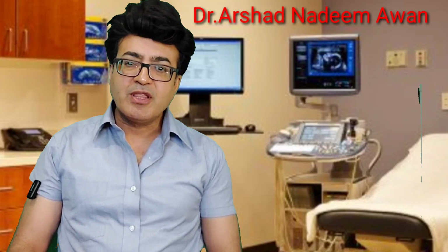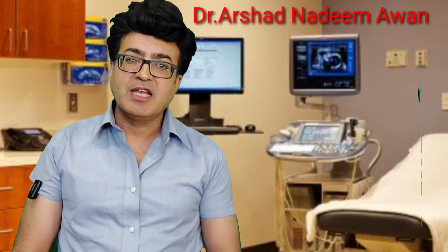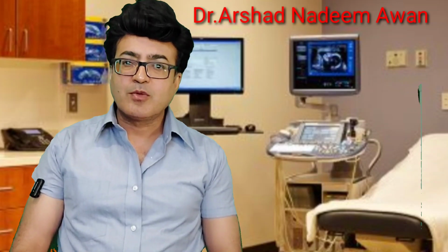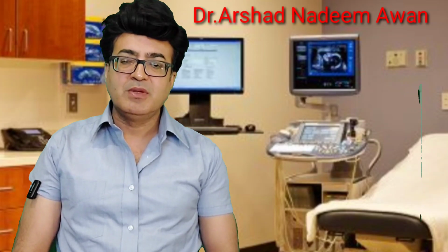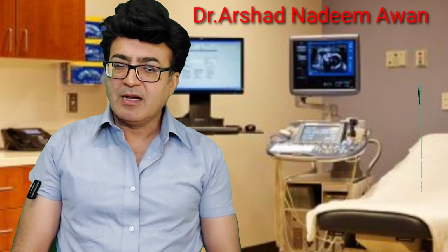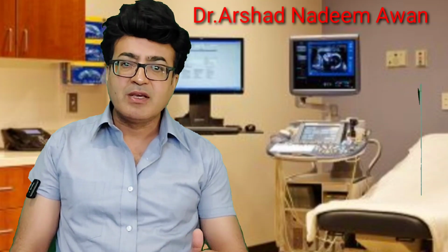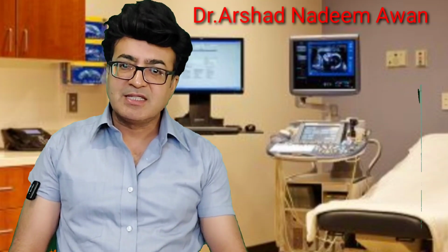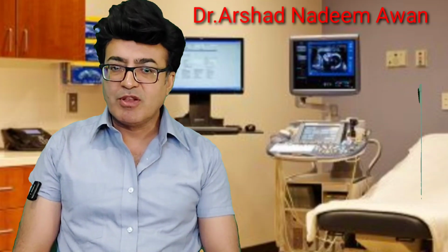So now the first important thing is when we will apply this term PID, and how many organs and structures will be involved in PID. Mind you that inflammation of the endometrium, inflammation of the fallopian tube, inflammation of the pelvic peritoneum and adjacent structures, if involved, would be considered as pelvic inflammatory disease.